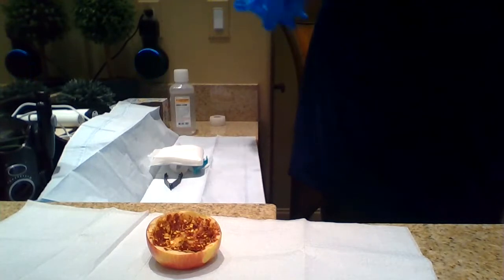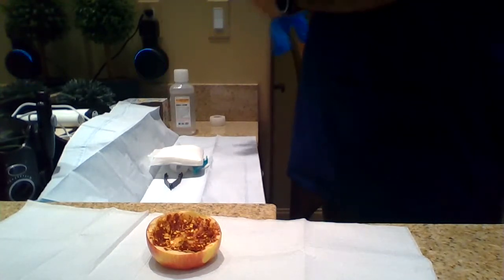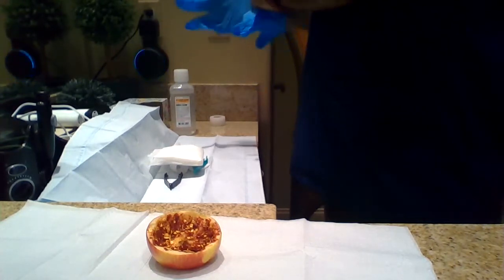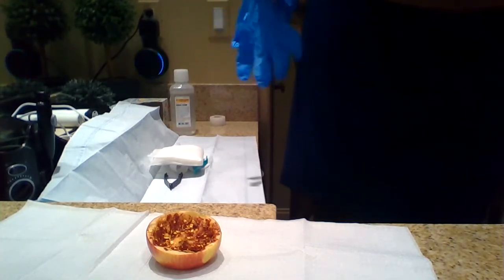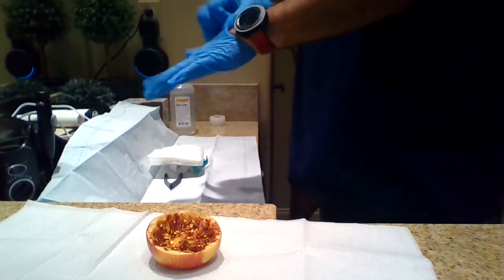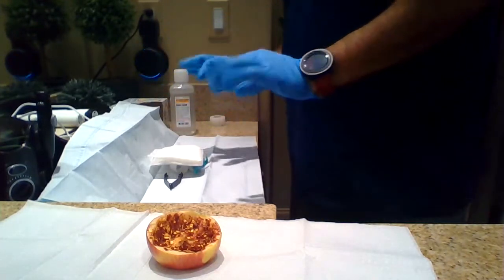So this is simulating donning sterile gloves. Already done that video. Save time. Okay, so now I have my sterile gloves.